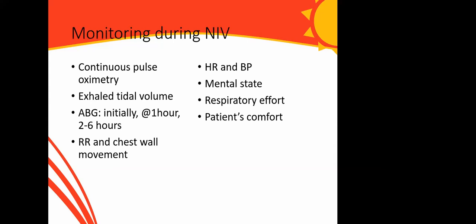So monitoring during non-invasive ventilation is important. You need to continue your pulse oximetry. You want to monitor your tidal volume. And like I said, for all the people that work with me, before you put a patient on any form of ventilation, you need to have baseline ABG values, and then another one hour after you put your patient on the ventilator to ensure that your settings are correct and meeting the patient's need. You need to look at the patient, monitor the respiratory rate and chest wall movement, and heart rate and blood pressure need to be monitored.